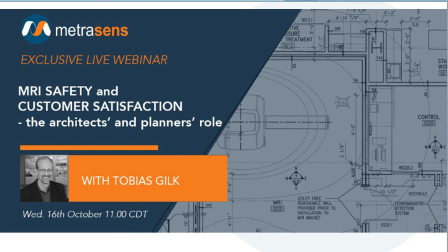Some of the contemporary ferromagnetic detection systems have logic functions that essentially negate signal from the door opening. In the body of the presentation, I talked about how that can be a conflict for some systems.